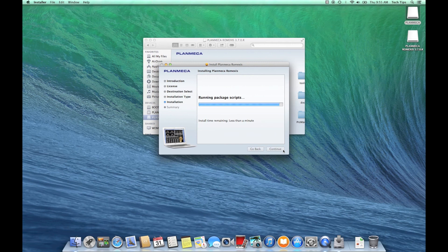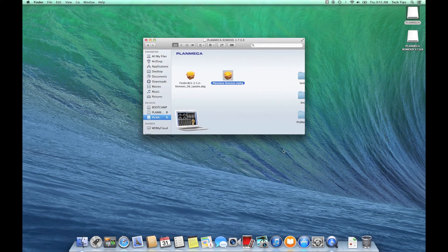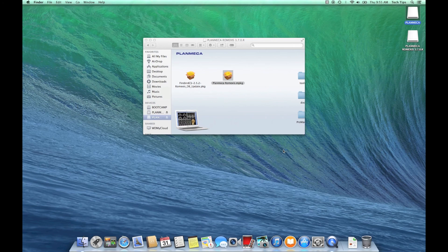There is some configuration that needs to be done after Romexis is installed and you can find that in some later videos. So keep watching and I hope you learned a lot. Have a good one.